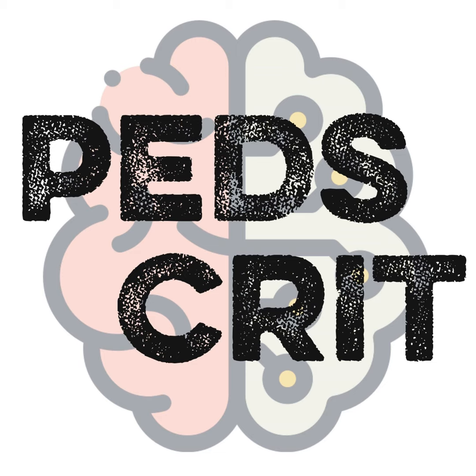So usually you clamp and then you wait for 10 minutes. And then you get a gas and lactate. And then what you call flashing the circuit, right? You actually remove the clamp, let the blood flow go through, and then you clamp again. So typically we do it about 40 to 60 minutes, like an hour. And I think that's good evidence to give you an idea whether this patient is ready for decannulation.